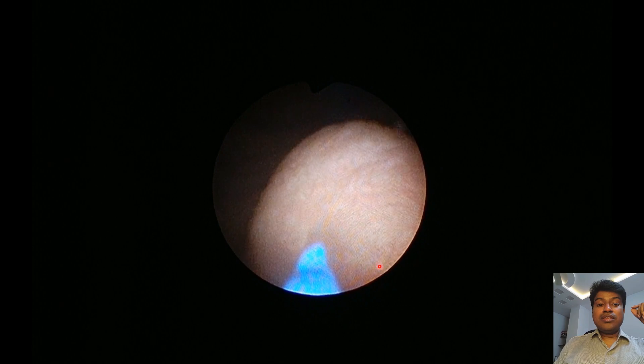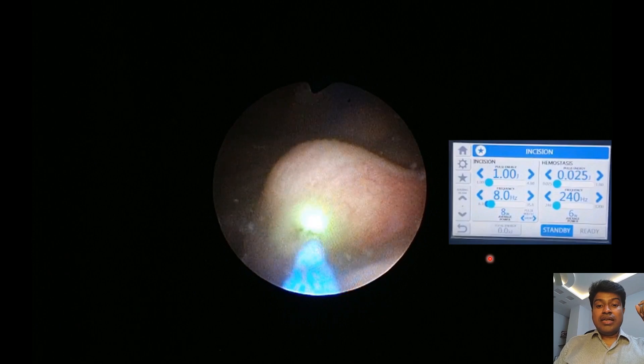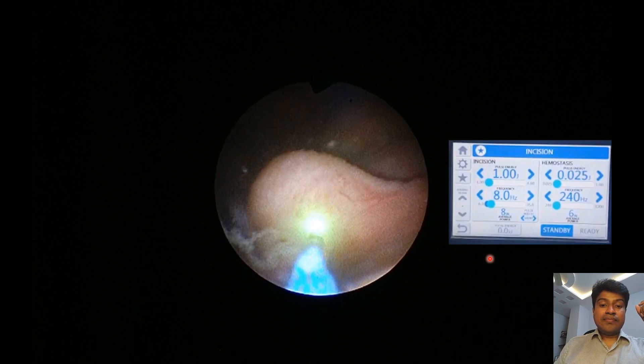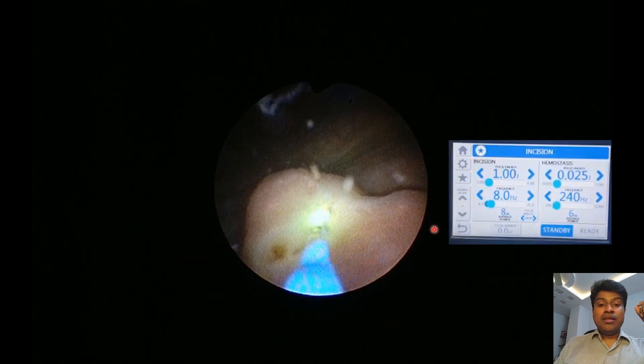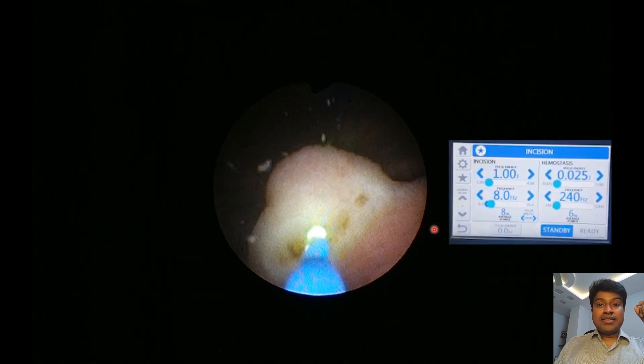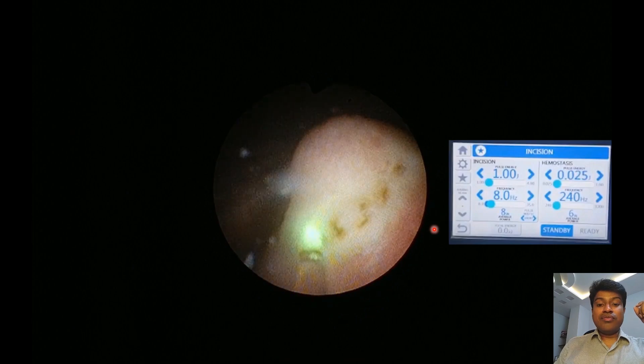We are now bringing in the thulium fiber laser at 8 watts power. We are creating the dots over the ureterocele. Do not deepen these dots until you are sure that you have created enough number of them.